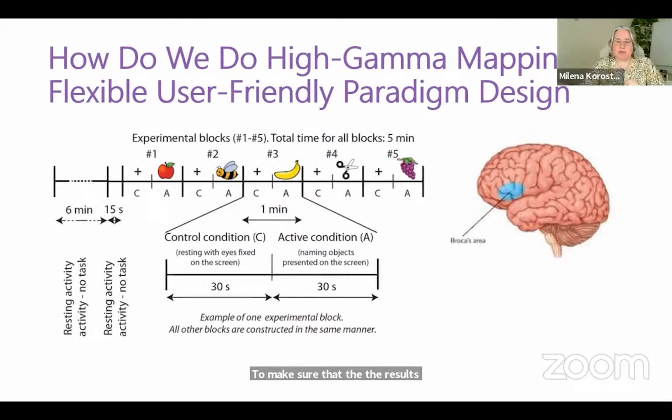However, I would agree with Dr. Tanaka that when we prolong the tasks and repeat them many times, the effect subsides, so we don't see that big change in gamma. There was a study, I think from g.tec, that showed how the power in the gamma spectrum decreases with repetition, even with time. This of course needs to be considered, but in general, any paradigms can be used.